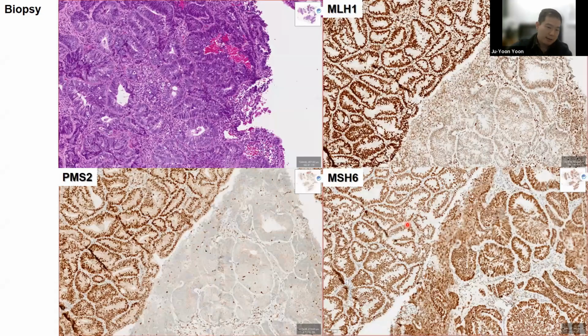But the interesting part, I think, is this: the H&E shows a combination of somewhat better separated glands, as well as glands that kind of fuse. And it's probably better seen on some of the immunostains, where you can see some of the rather discrete glands right here. So this is better fitting with precursor or endometrial intraepithelial neoplasia, whereas in this area the architecture is a little more complex, so it's better fitting with carcinoma.